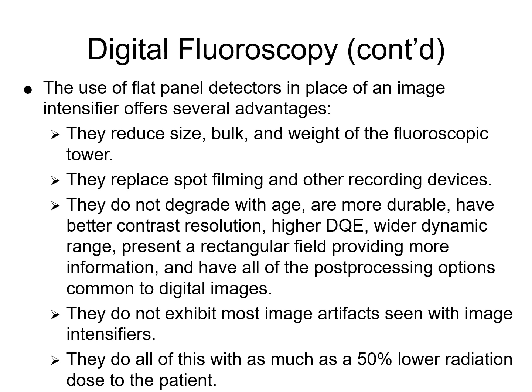And then typically, again, across the board from obsolete technology, we're doubling the efficiency of the image receptor. That's just baseline. Now, some of the DR technology is more efficient than others, but on average, we're doubling the efficiency of the image receptor at catching the X-ray, and so therefore we can use half the amount of radiation and still get a good image.